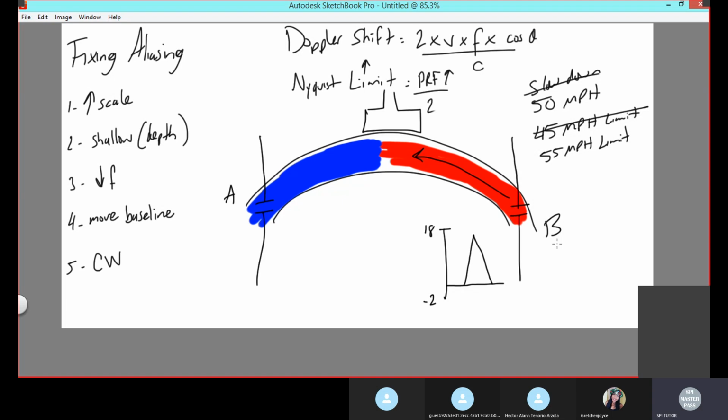And I want it to be a big number because maybe this wave is fast. Okay? Because imagine if right here it was just 2. And look how big this wave is, I would have aliasing. Okay, so if your wave is above the baseline, just make that your priority. Lower the baseline so that you can appreciate the wave above it, okay?